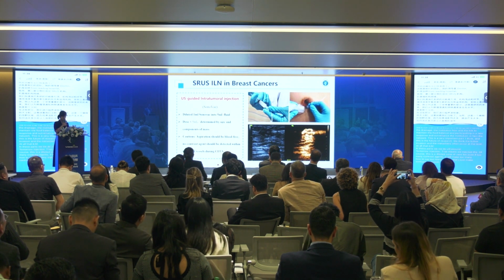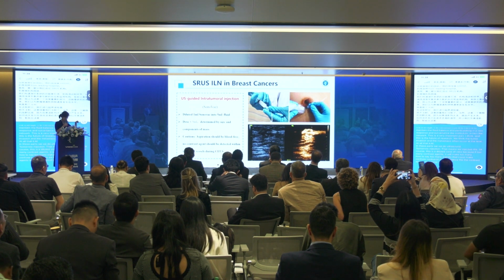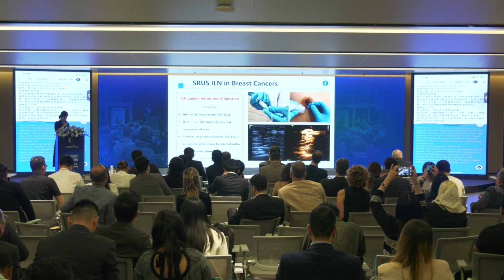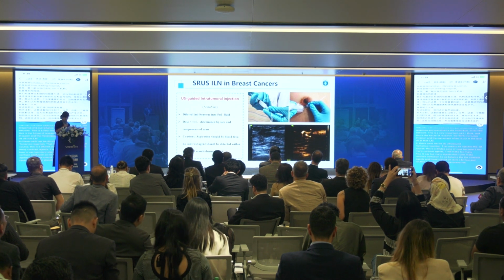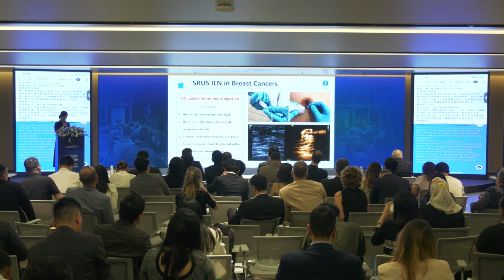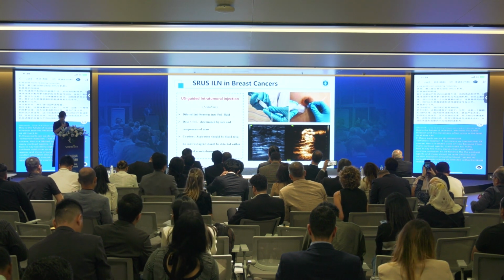So we dilute the contrast agents, and the dose should be quite low. And caution: aspiration should be blood-free, and no contrast agents should be detected within the blood vessels during the contrast-enhanced ultrasound.